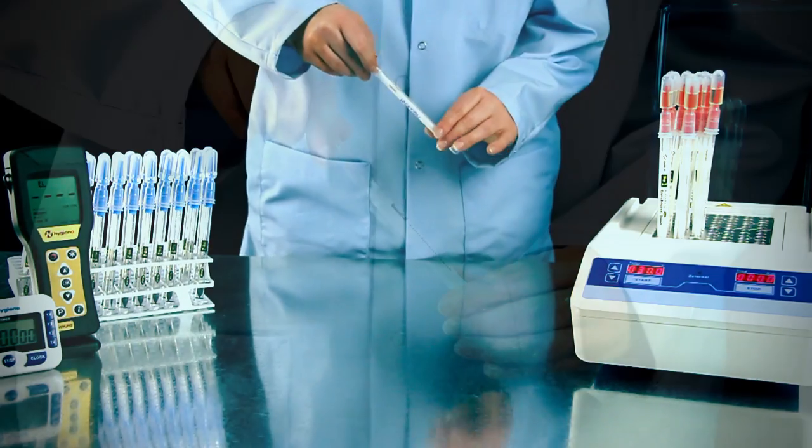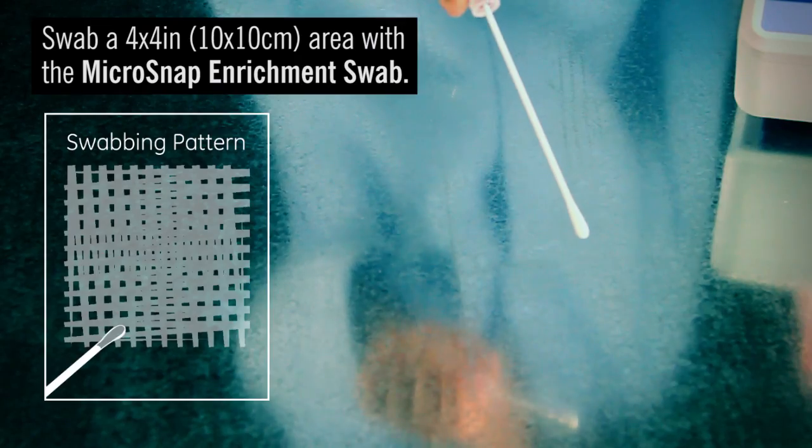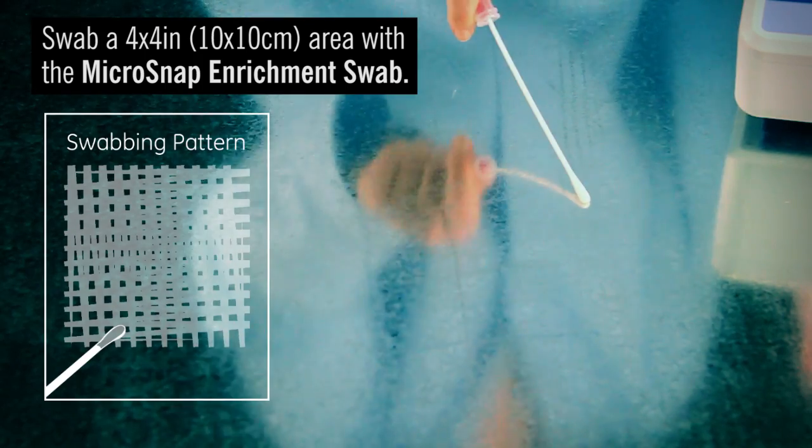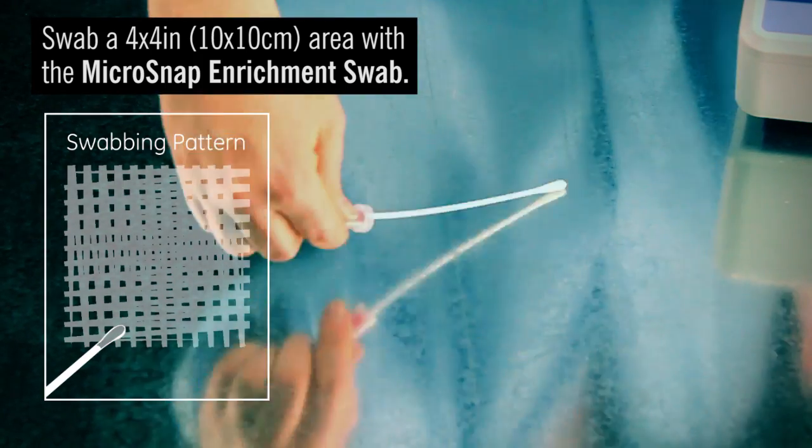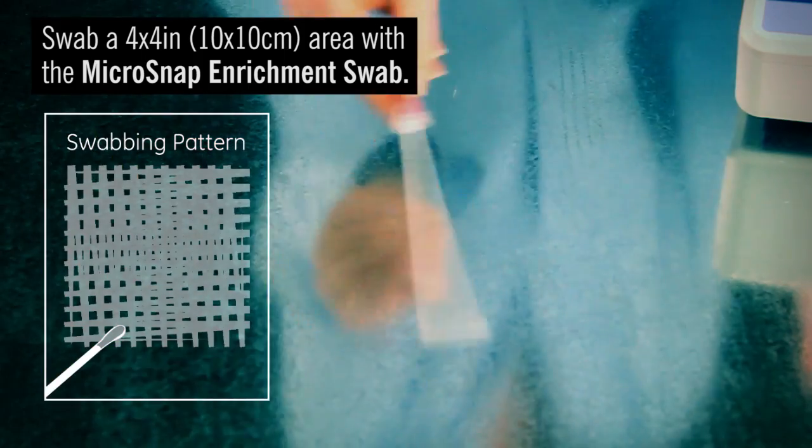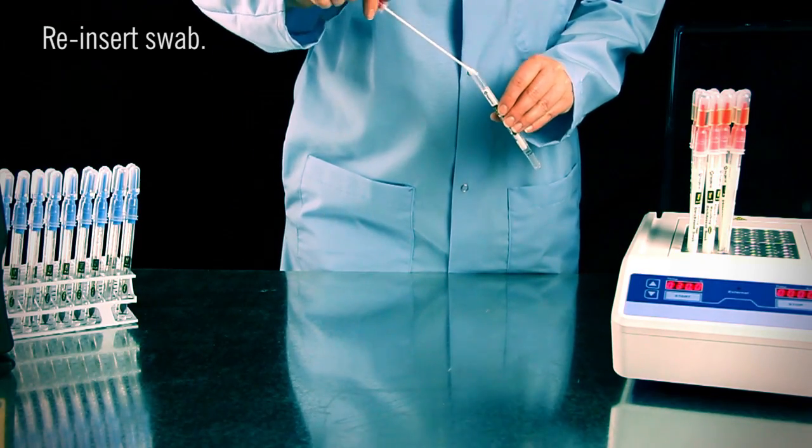Remove the swab from the enrichment device. Swab a 4x4 inch square area, applying sufficient pressure to create flex in the swab shaft and rotating to collect sample on all sides of the swab tip. Replace the swab in the tube.